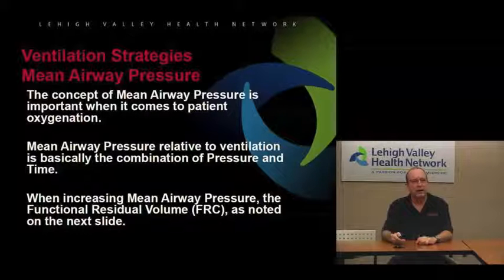If you just have higher airway pressures during inspiration, like with your pressure control ventilation, or whatever pressure you have for your peak inspiratory pressure or your plateau pressure with your given volume, it's only there during the inspiration cycle. So just keep that in mind. So your mean airway pressure, again, is just a combination, in some complicated formula, of pressure and time during your mechanical ventilation. And when you're increasing mean airway pressure, the functional residual volume is increased.